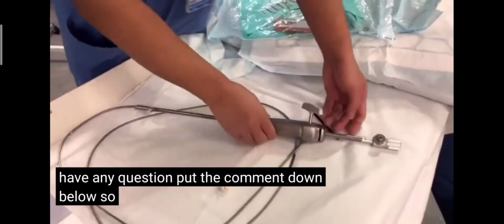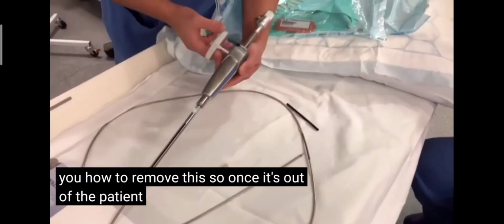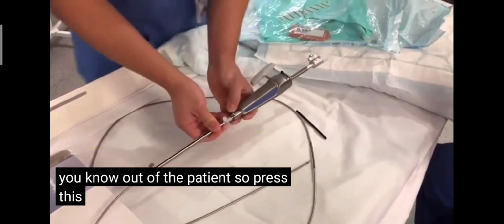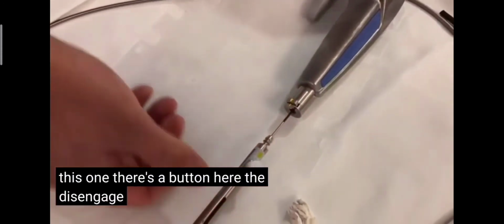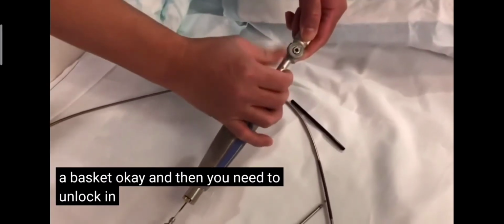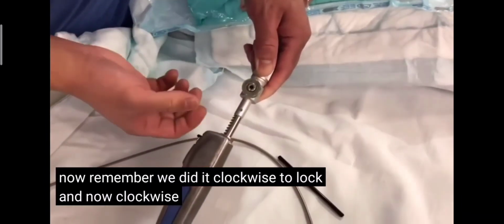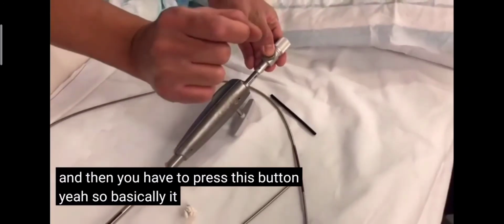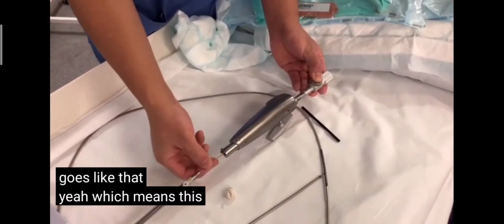So how to remove this? My colleague said to show you how to remove this. Once it's out of the patient, press this one. There's a button here that disengages our mechanical lithotriptor basket. Then you need to unlock in here, counterclockwise now. Remember, we did it clockwise to lock, and now anti-clockwise, sorry. Then you have to press this button. Basically it disengages the mechanism inside it. When you press it, it goes like that, which means this is free.